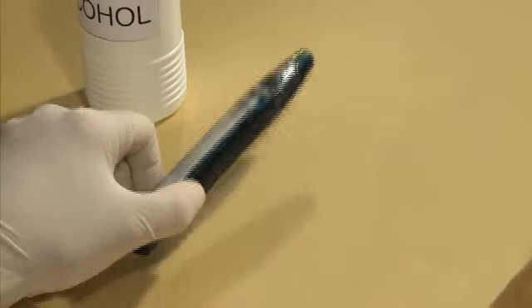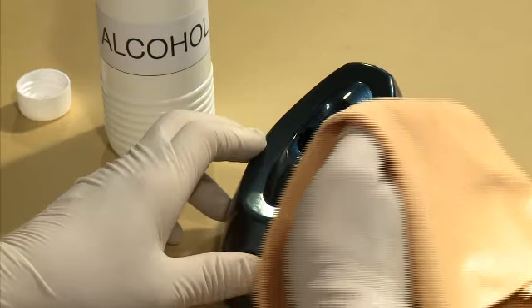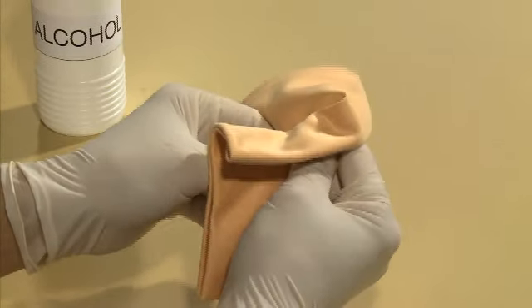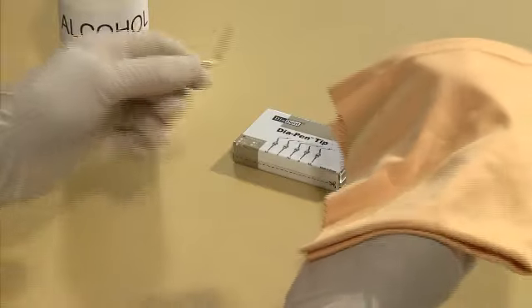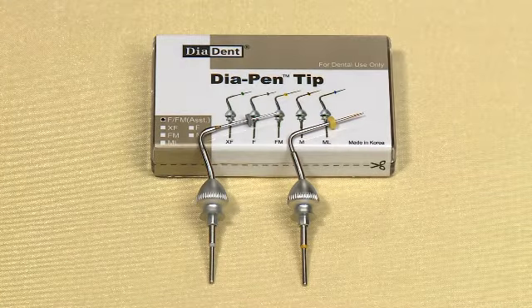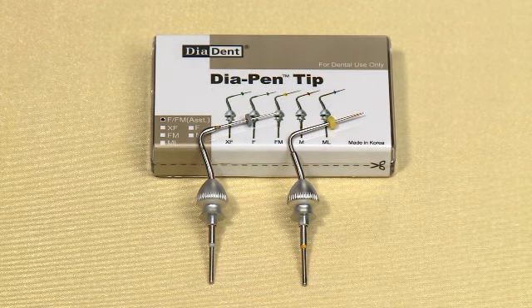Use a soft towel dampened with mild detergent or rubbing alcohol to clean the surface of the Diapen handpiece. The surface of the charger contacts and the charger base can be cleaned with a cotton ball dampened with alcohol. Remove all visible soil from the pen tip, then steam autoclave at 132 degrees Celsius for 12 minutes. Clean, disinfect, inspect, and steam sterilize the pen tip using a steam autoclave before and after each use.